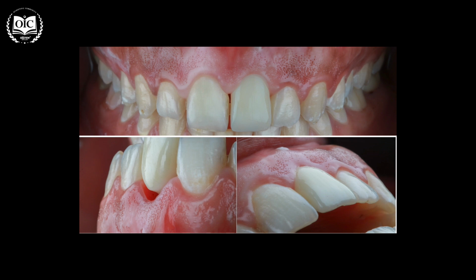This is how it looked. Beautiful, patient satisfied from since day one she entered our office to the final delivery of the crown. Never 1 day without a crown.